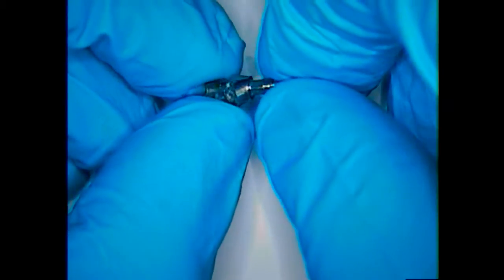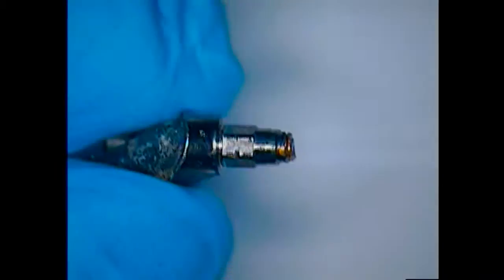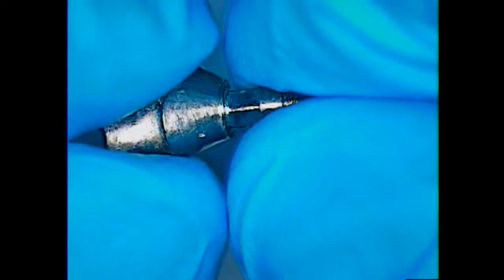All the other implants in the mouth are doing just fine. This one just happens to have a fractured screw. The patient saw my video on the internet and now they want me to go ahead and retrieve the broken fragment. Visualization is important.